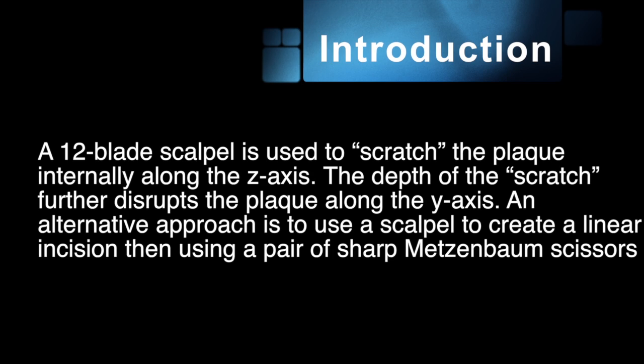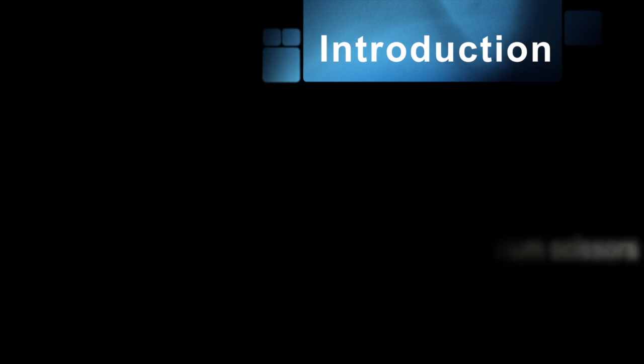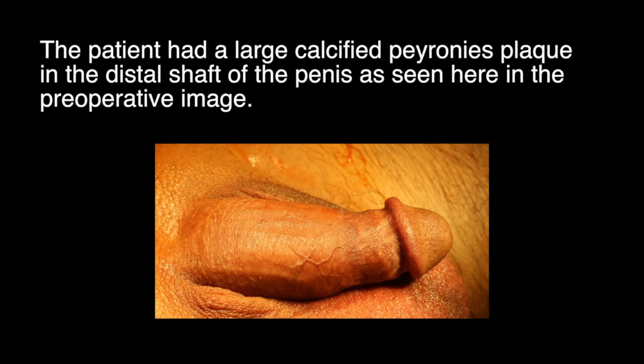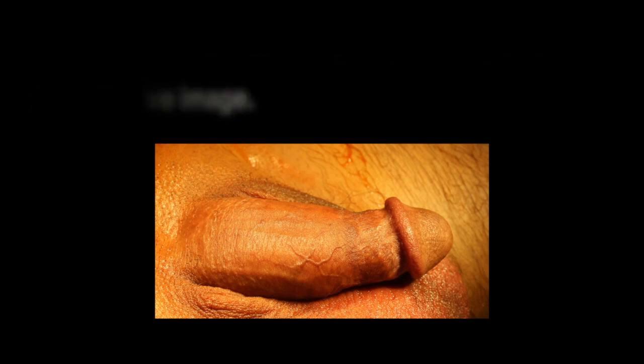An alternative approach is to use a scalpel to create linear incisions. Then, using a pair of sharp Metzenbaum scissors, one can fracture the plaque. In this case, the patient had a large calcified Peyronie's plaque in the distal shaft of the penis, seen here.